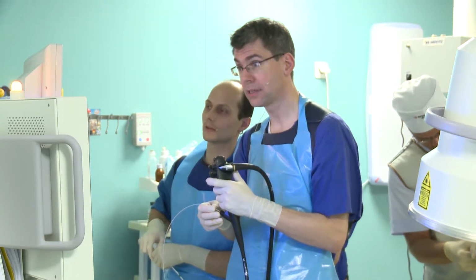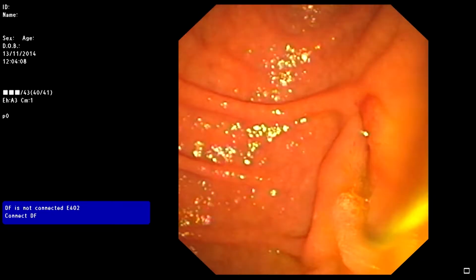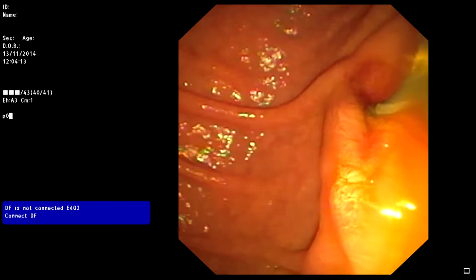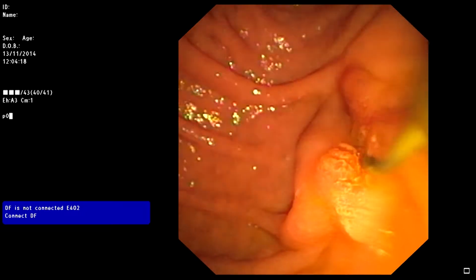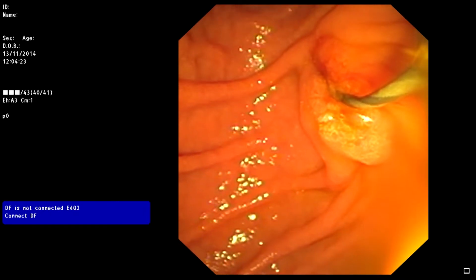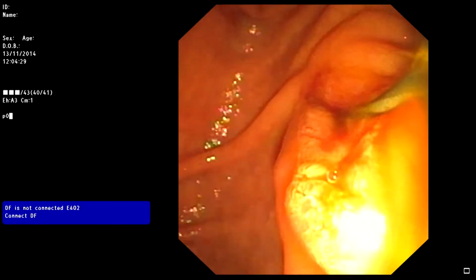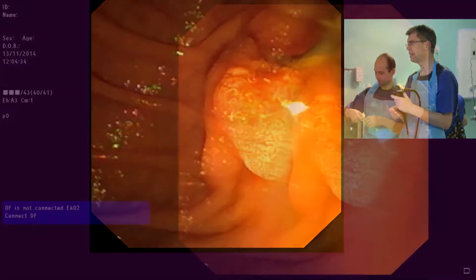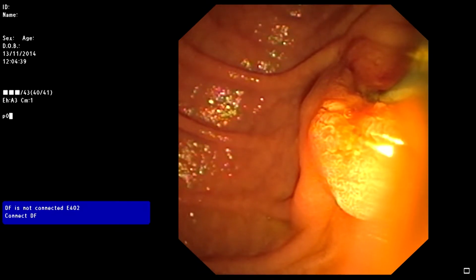Somewhere near the elevator. Not yet, not yet. Something is wrong with the guide wire. We have some technical problems with bringing in the guide wire. It's quite hard, for some reason it's quite hard to move it in. A technique here: advancing the small balloon over the wire.